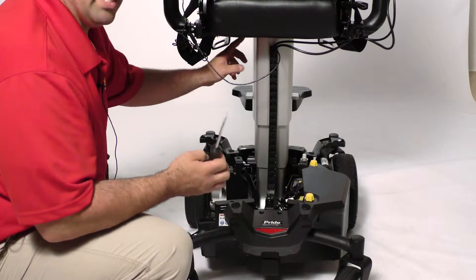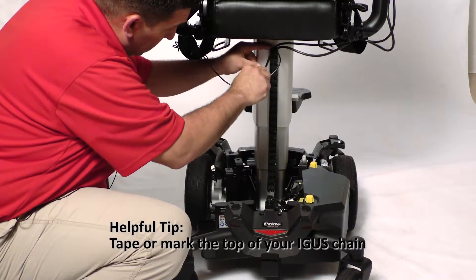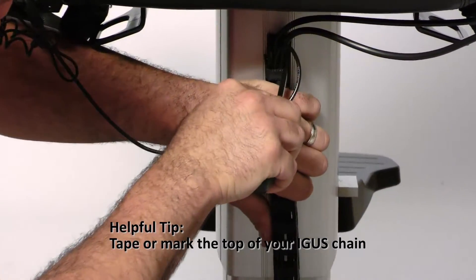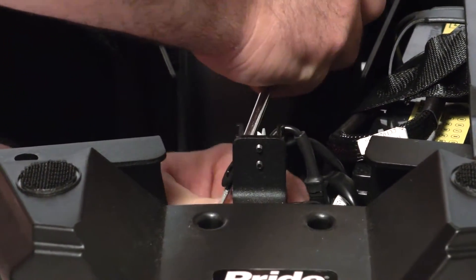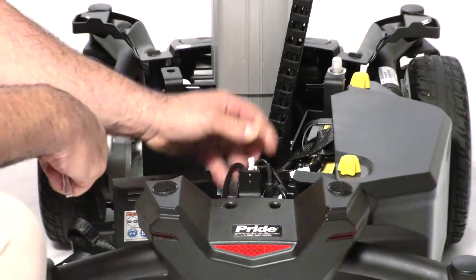We want to remove the igus chain with your straight slot screwdriver by just popping it off from the top portion and the bottom. Just be careful because it is plastic not to break it.